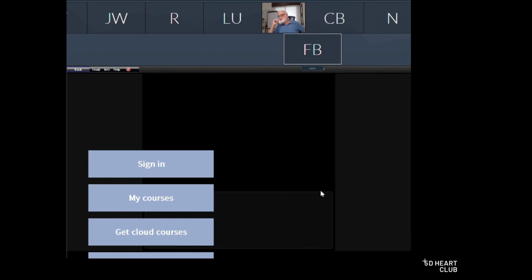If they don't align, then there's a problem. There's a sign of possible suspicion. Yes, possible. Because the marking may also mislabel, so you need to be careful. Everything contributes to raise the suspicion.